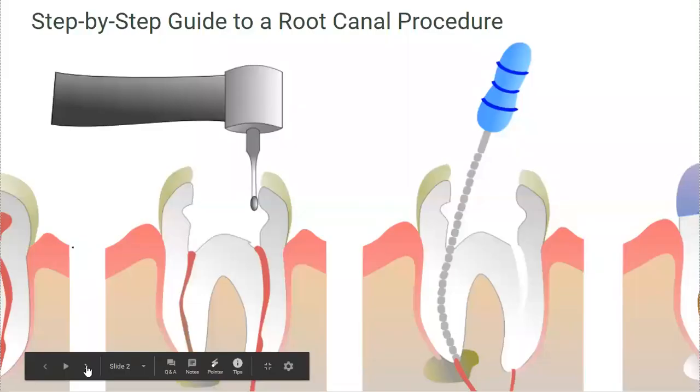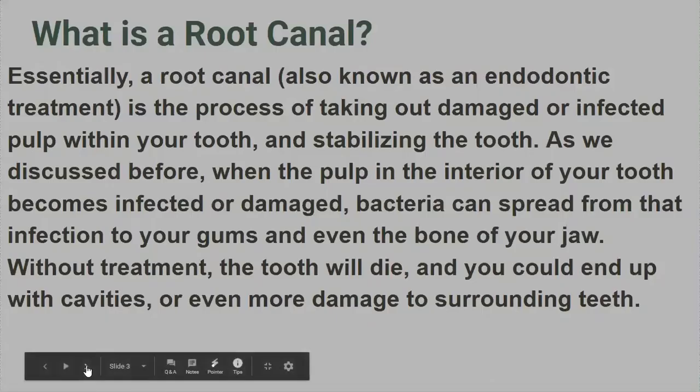This is a step-by-step guide to the root canal procedure. What is a root canal? A root canal is also known as endodontic therapy. It's a process of taking out damaged and infected pulp within the tooth and stabilizing the tooth.